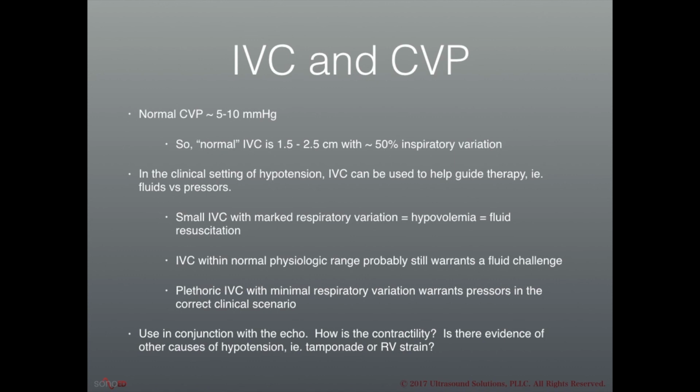This is not a decision that I feel should be based on the IVC alone. I think it needs to be taken in the context of what the patient's heart is doing when you do their cardiac ultrasound. How is their contractility? Is there anything else that could be contributory? And only after you have all of that information should you make a decision. And of course, you're always taking the patient's clinical context into consideration.